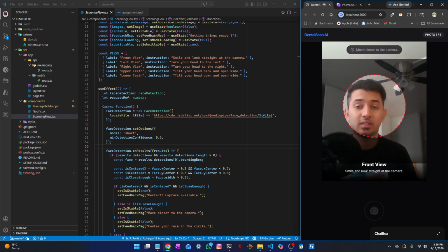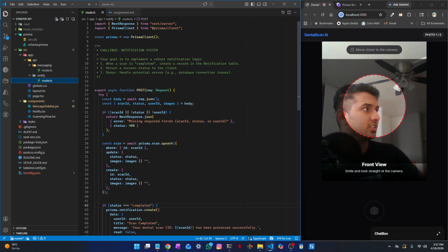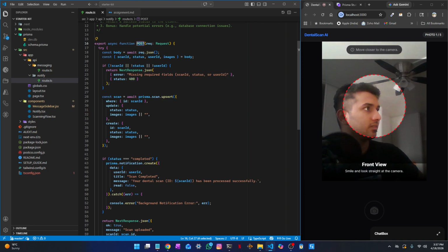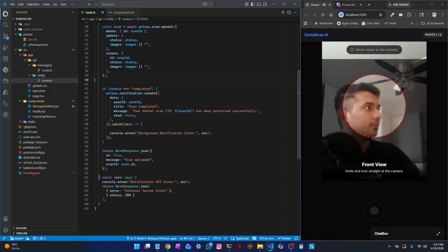So basically one more improvement that I have in mind is to chunk the data and stream it to the backend. If given a chance, I would love to implement this, but just for the sake of this demo, I've just stored the data as base64 and hit an asynchronous API call to the backend. So this is how I hit the data. I've just made a POST request, and this is the data I've collected. And yeah, I've used upsert.